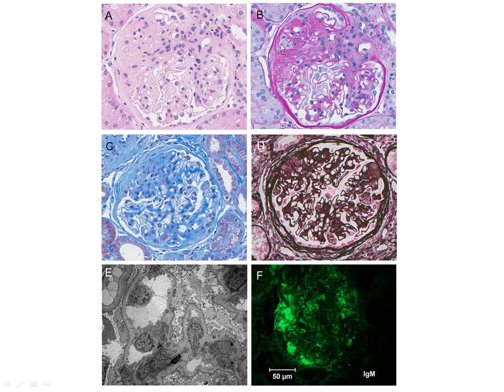But I think we can see within the panels A through D, there are serial sections of the same glomerulus stained with H&E on A, PAS on B, trichrome on C, and D is a JMS. And I'm assuming for some of these panels, boards would actually tell you which stain is which.